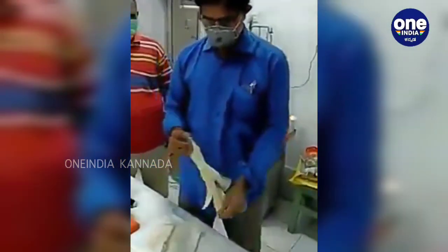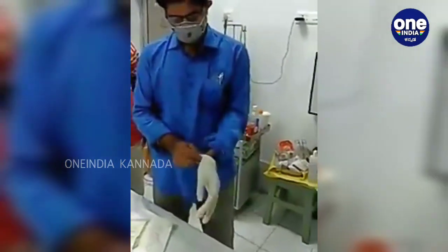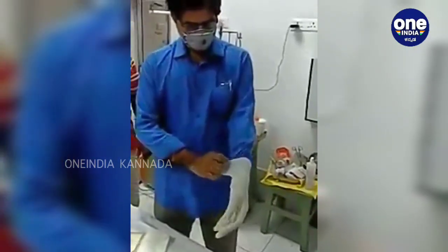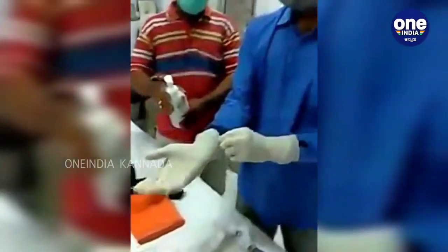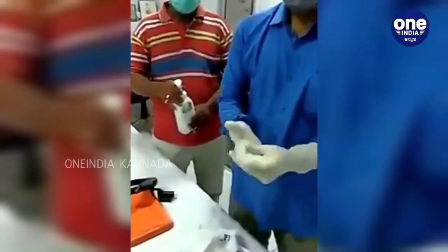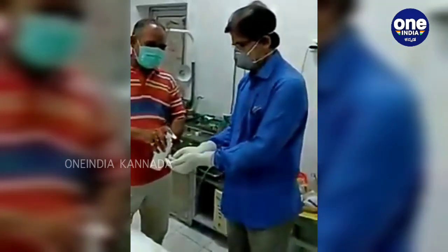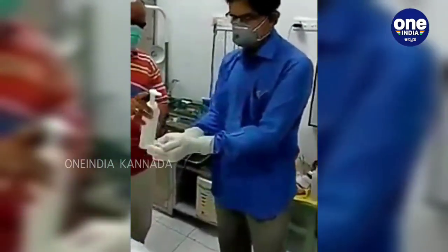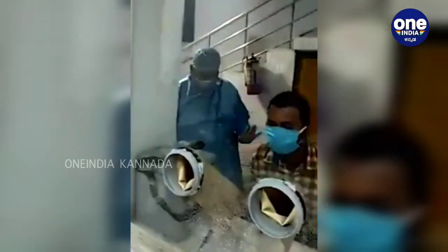This is the second case for which the sampling will be taken by Dr. Ravikant again. It is getting ready and almost ready. The doctor is sanitizing the hands with sanitizer. The patient is also ready, and the area has been sprayed another time.